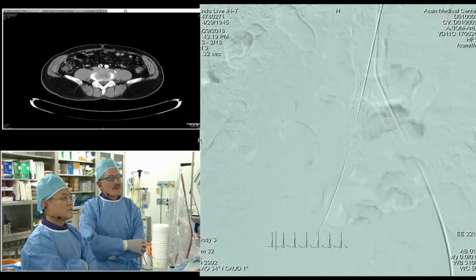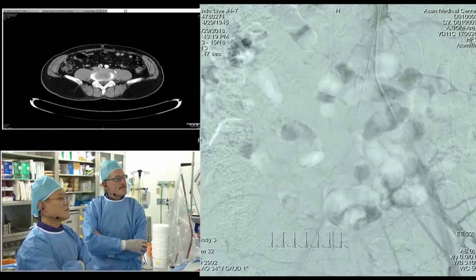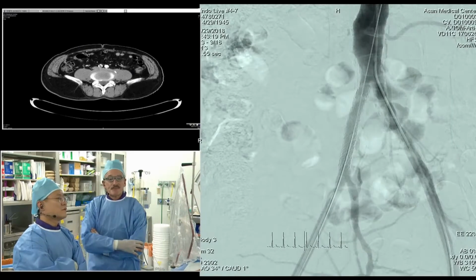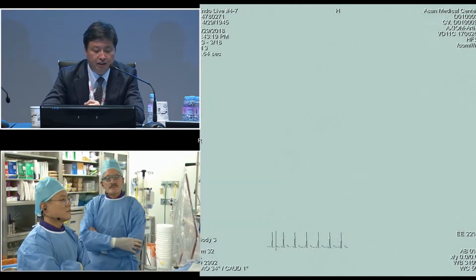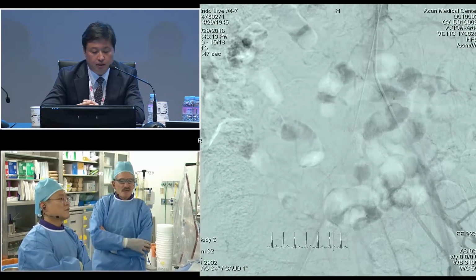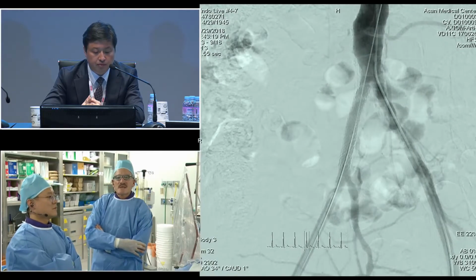Dr. Burstein, can we make it bigger after we place the LifeStream balloon expandable stent, with the larger balloons? I heard that there's a limitation on making it bigger. There definitely is. With the LifeStream, I have to look at the box on the 7 millimeter, but I think it's a maximum of 10.